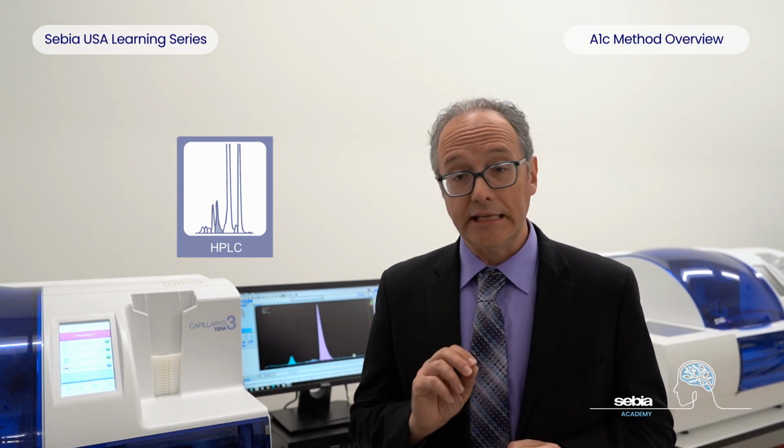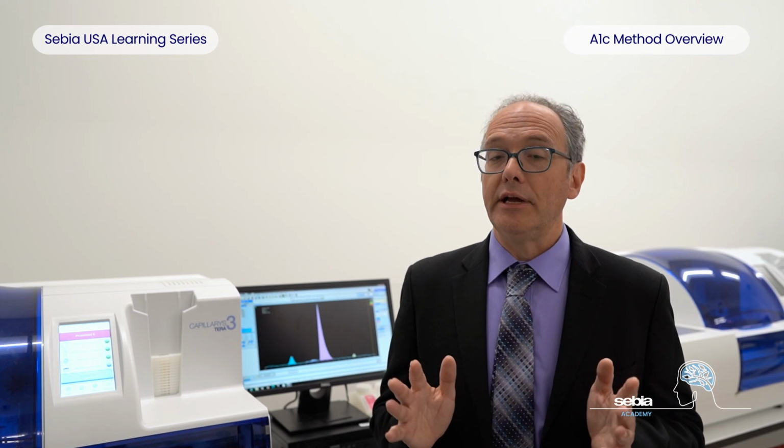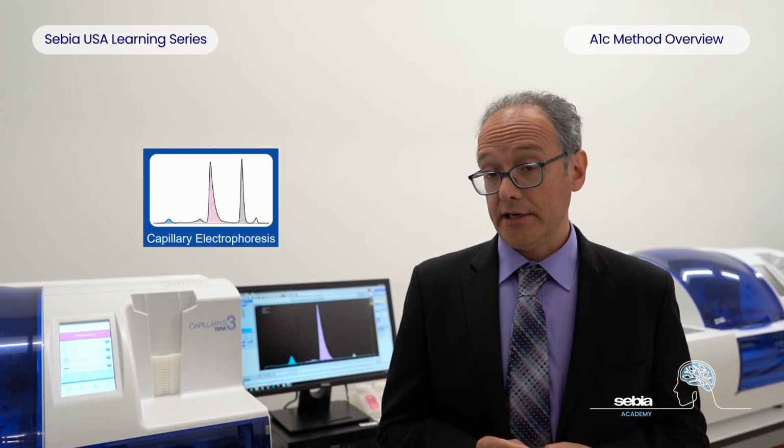This is an improvement in the case of hemoglobin variants, as many variants can be detected as separate and different from normal hemoglobins. Sebia's capillary electrophoresis, or CE, shares this advantage.